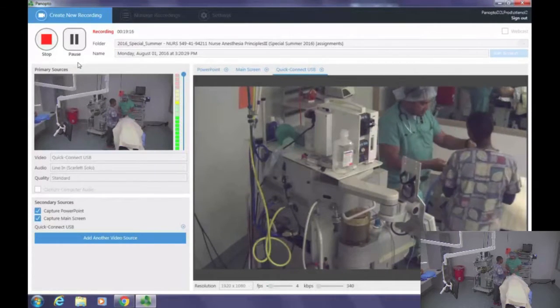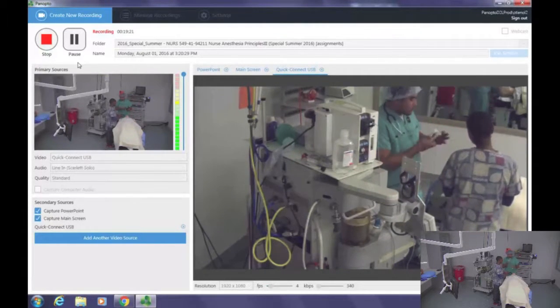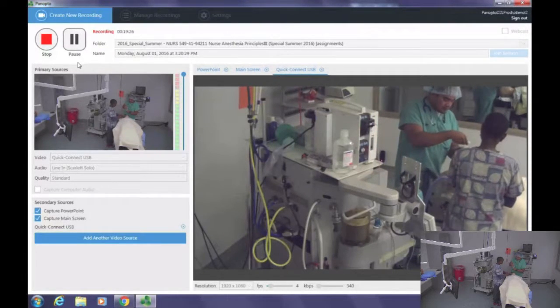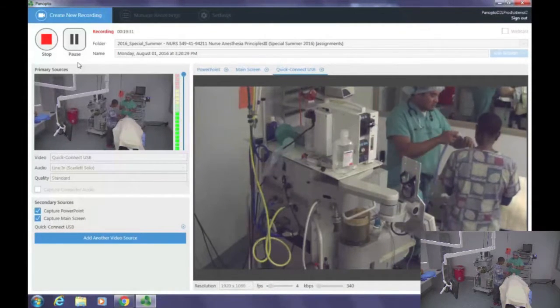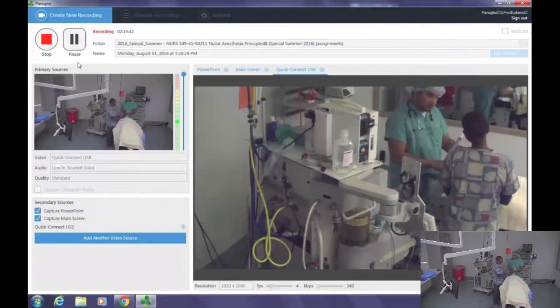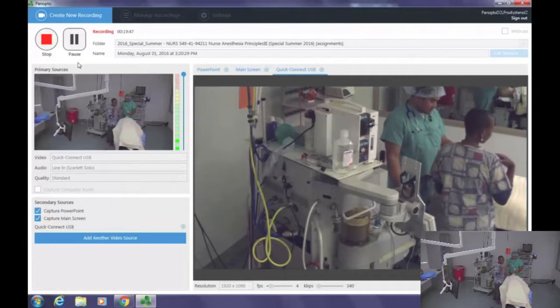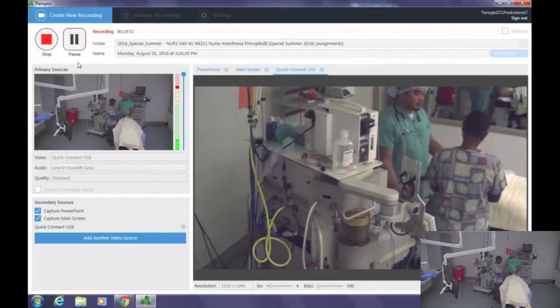And then you're going to inflate the tracheal cuff first, and then for this DLT we're going to use the adapter. Oh, no, not yet. What we're going to do is ventilate the patient. I see bilateral chest rise. We see the mist, and you see the CO2 there. We're going to have a stethoscope. I'm going to go ahead and listen. At this point, we're still ventilating bilaterally.